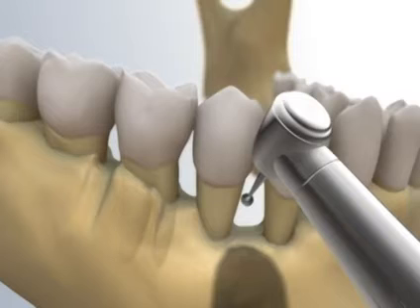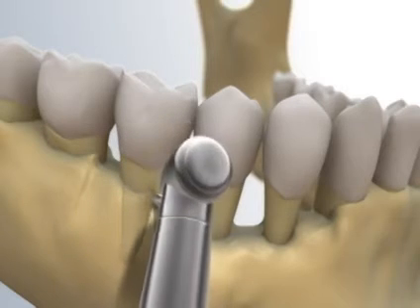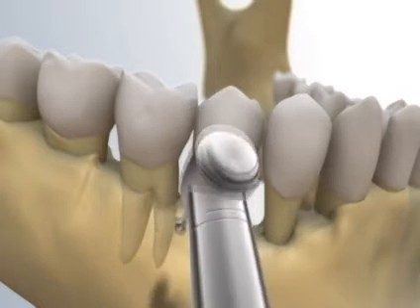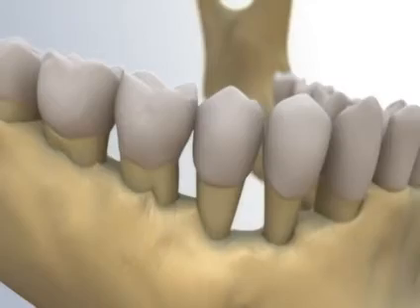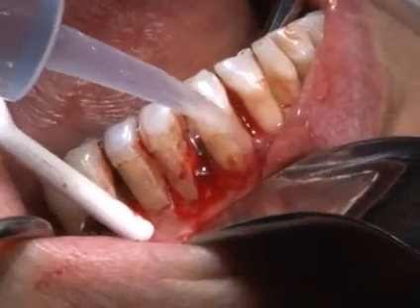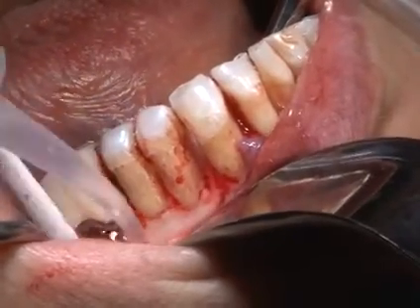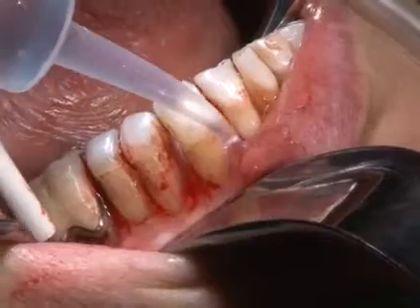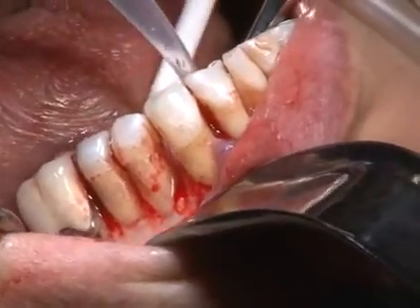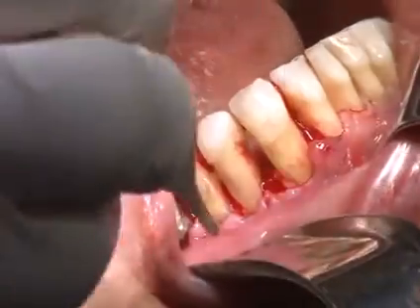For tooth 4-6, the mesial and distal roots of the molar should be treated as two premolars. Caution must be exercised in order not to remove bone in the furcation. Following osseous resective surgery, thoroughly irrigate the surgical site, especially under the flaps, with saline to remove any debris. The mucoperiosteal flaps are apically repositioned to cover the bone at its new level.